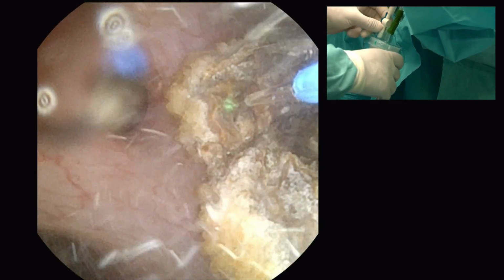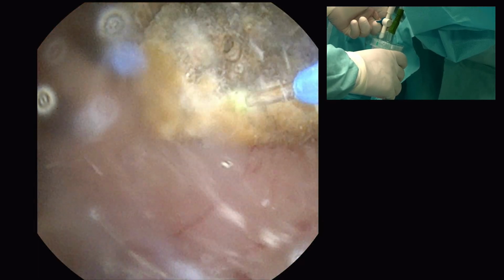Actually, we can do it. The thing with spinal is that we should not be able to hold the ventilation, so diaphragmatic movement would be there.